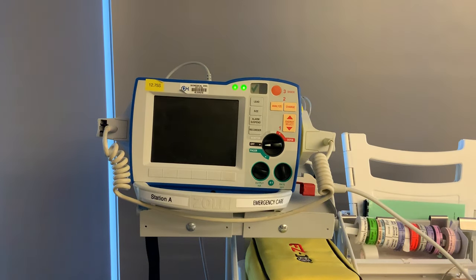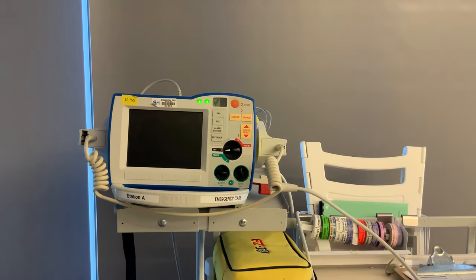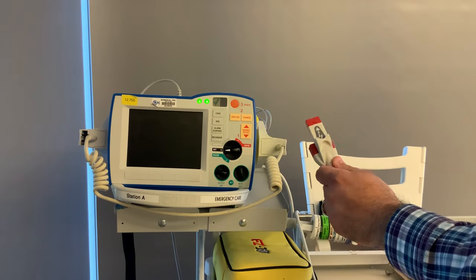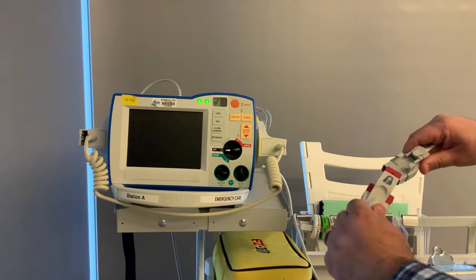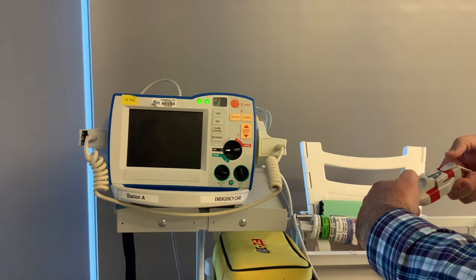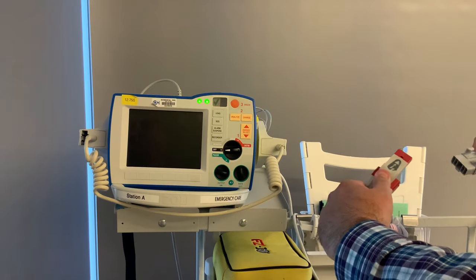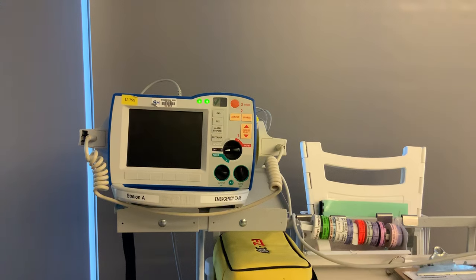If we're going to use our defibrillator, the first thing you're going to do is connect your pads. To connect your pads, first you're going to pull the therapy cable out from the spot where it should always live. Grab your pads and connect them until the clip clicks in. If you need to take the pads apart, pull on the rigid edges of the clip and the other edges on the therapy cable and pull your arms apart.